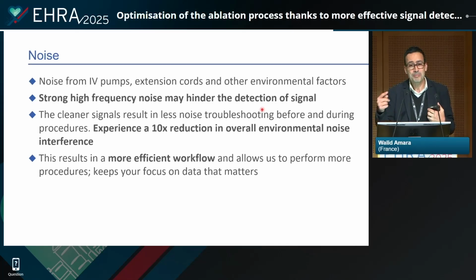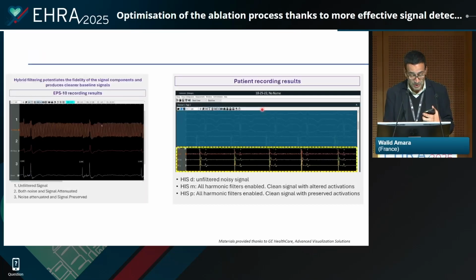And maybe you can miss that there are some amazing tools available to reduce the noise, and you can just click and suppress the noise. Just go to your system settings, and you see that there are some amazing filters that you may enable or disable. Some are automatic, and then you can control them.